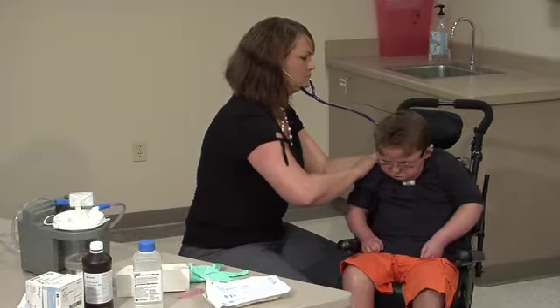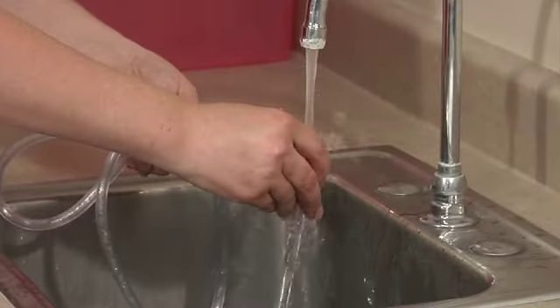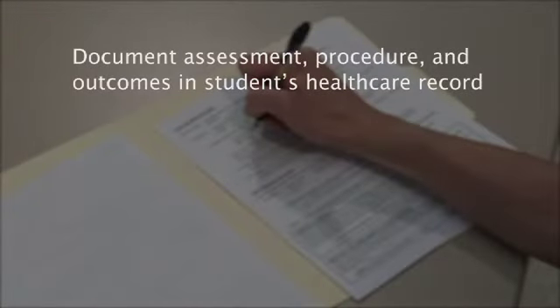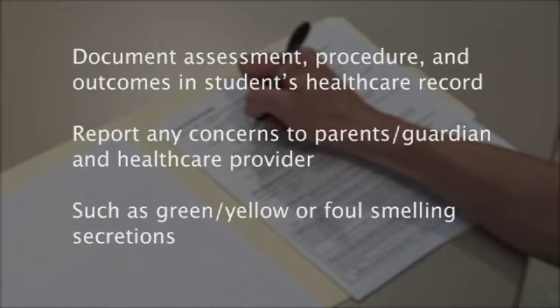Remove your gloves. Assess the student's respiratory status. Rinse the suction machine tubing with tap water. Wash your hands. Document the assessment, the procedure, and the outcomes in the student's health care record. Report any concerns to the parent and or health care provider, such as green or yellow or foul-smelling secretions.